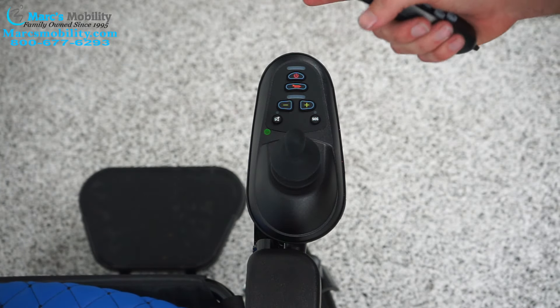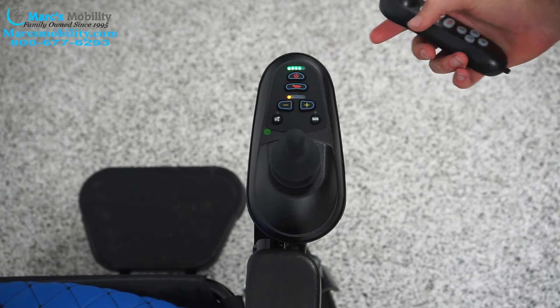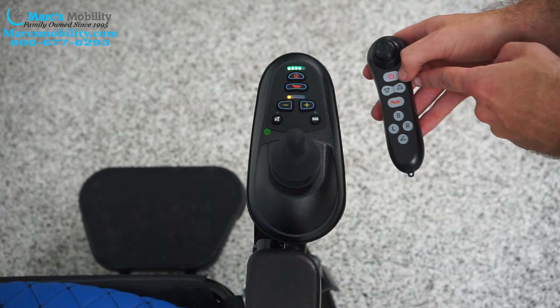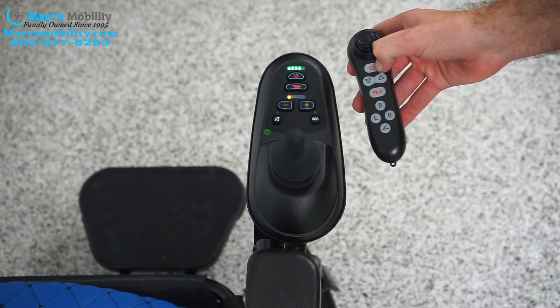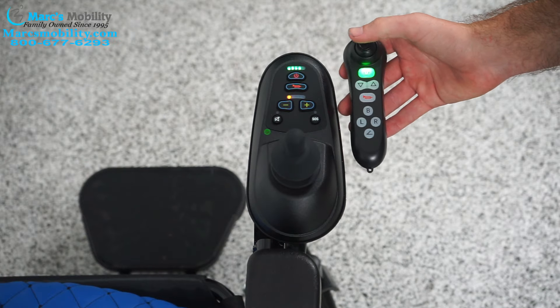To start, we're going to have to have both the joystick and the remote turned on. We'll turn the joystick on with the power button. For the remote, you have to hold the power button for 5 seconds. You will see it turn green — now it's on.